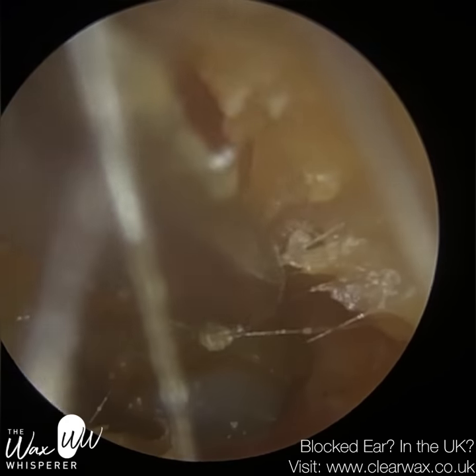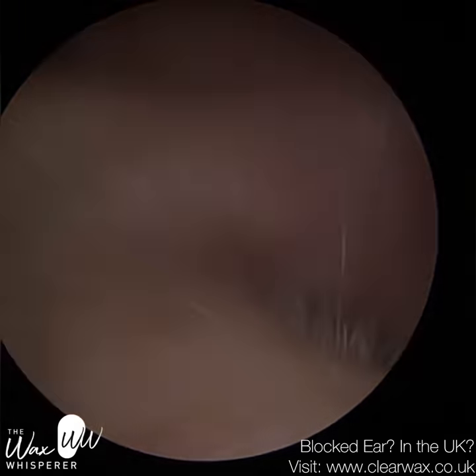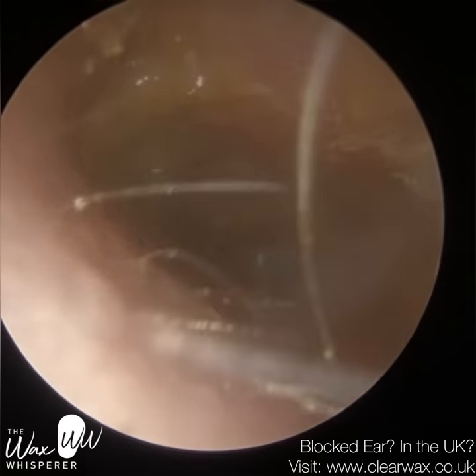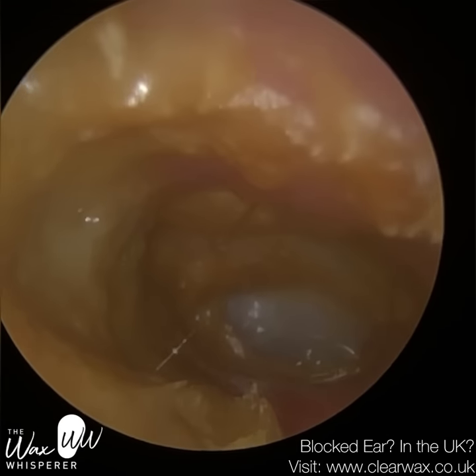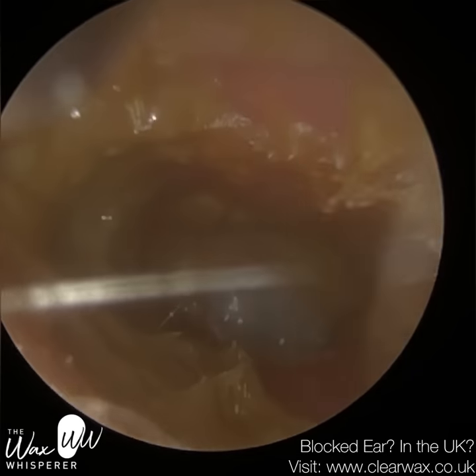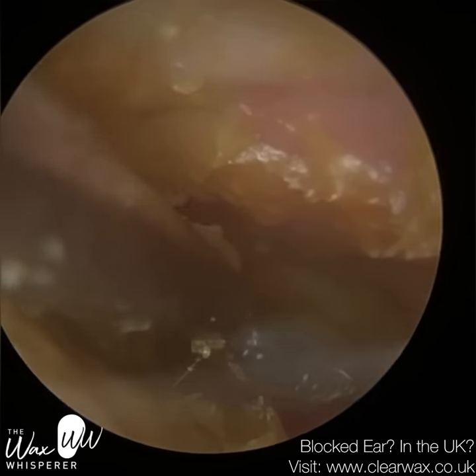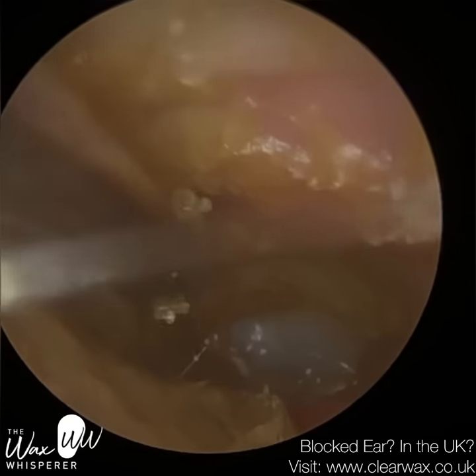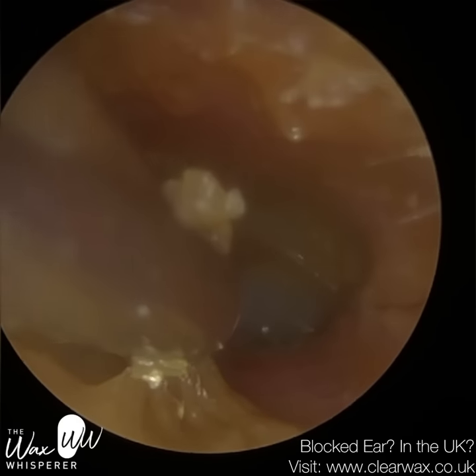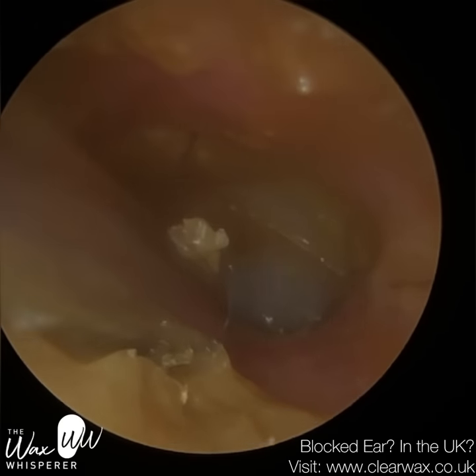I'm just slowly working on the back part of the ear canal here. You can see there are a few hairs — these should only be located on the outer third, the cartilage portion, which the majority are, as you can see. That's because the cartilage portion of the ear canal contains the dermis layer of skin. The skin that lines the ear canal varies depending upon its location — the outer third skin is quite thick, about one millimetre, and it has three layers.